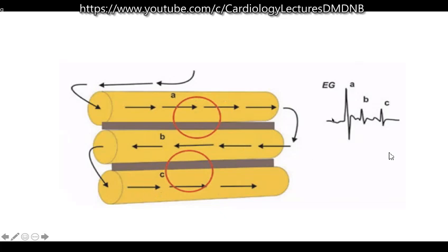So whenever there is a very long conduction, my electrogram duration also increases. Instead of a very crisp electrogram like electrogram A, which I have depicted, my catheter will record a very long electrogram. It's like a very long QRS that we see in a dilated heart.